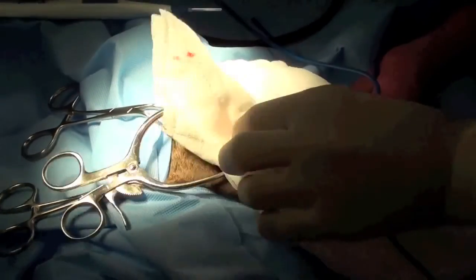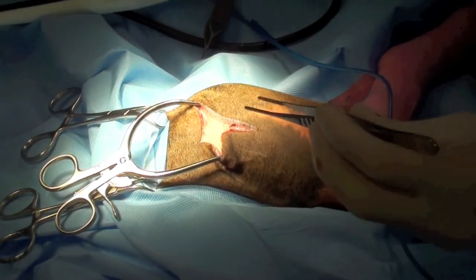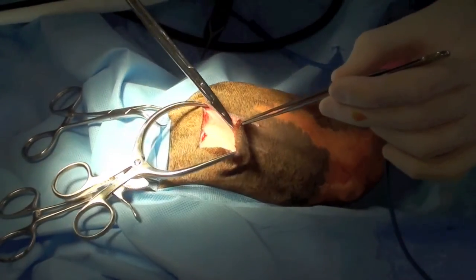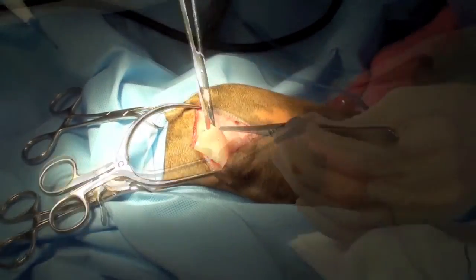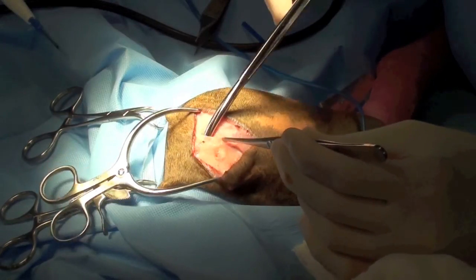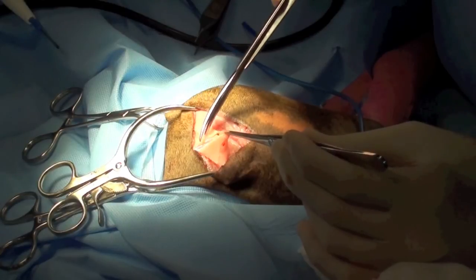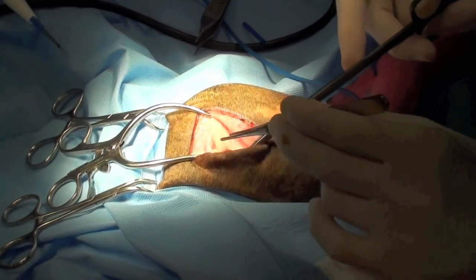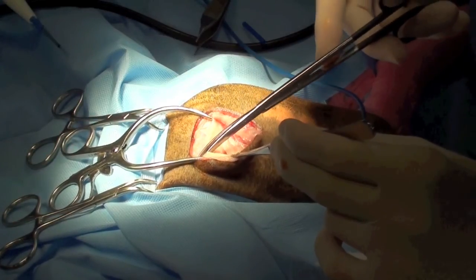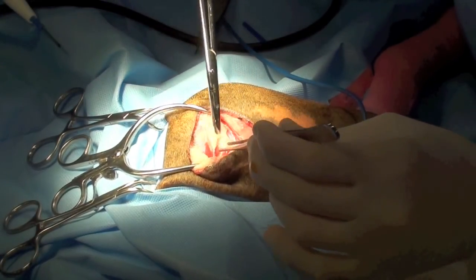Gelby retractors are used to retract the skin out of the way so that subcutaneous dissection can be performed. A combination of sharp and blunt dissection is used to dissect through the subcutaneous fat. The division between the superficial gluteal muscle and the tensor fasciolata is dissected.